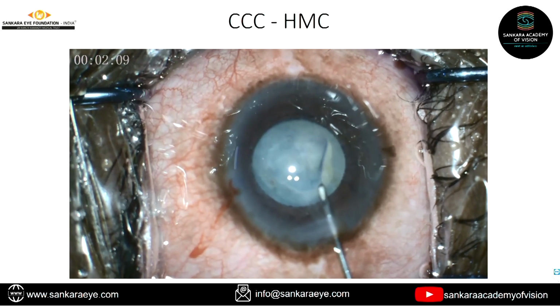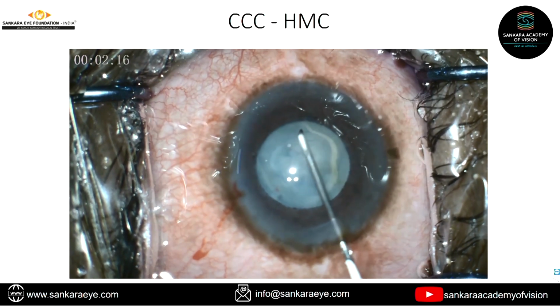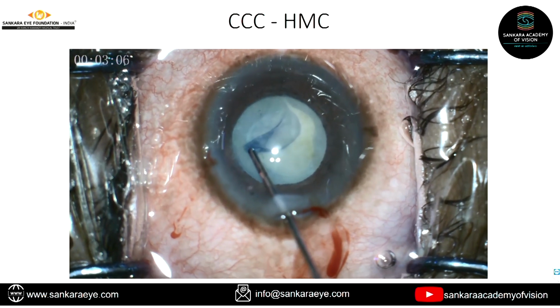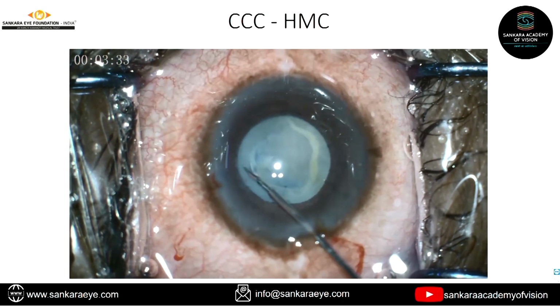See this? I've crossed the 6 mm zone now, and the rhexis is trying to extend, but somehow I'm still continuing with the needle. This should not have been done actually. I should have stopped and used a forceps. So now the opposite side I'm going now. It's because of the hypermature cataract, the anterior capsule is calcified. See, I'm trying to pull, nothing's happening.